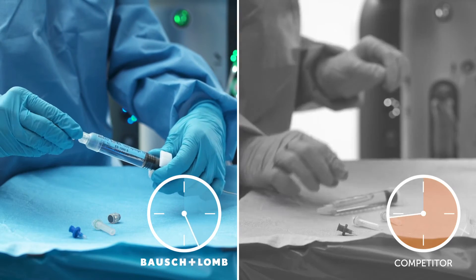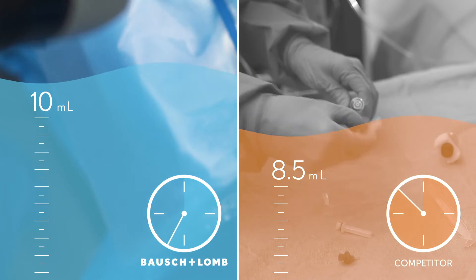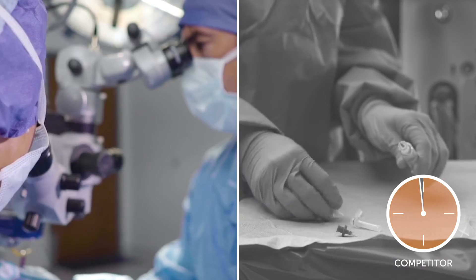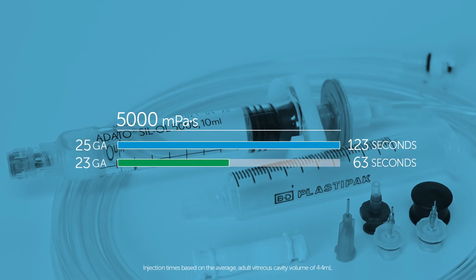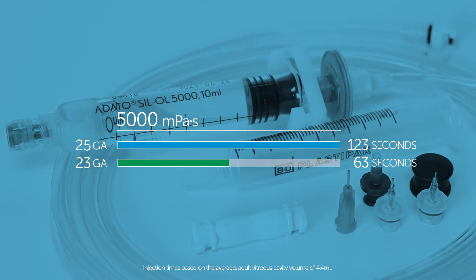The Adato 5000 provides an additional 1.5 milliliters of oil than the leading competitor, so in most cases, one syringe will do the job. The 25 and 23 gauge high-flow cannulas improve the efficiency of the oil injection while eliminating the need to enlarge sclerotomies during small gauge procedures.